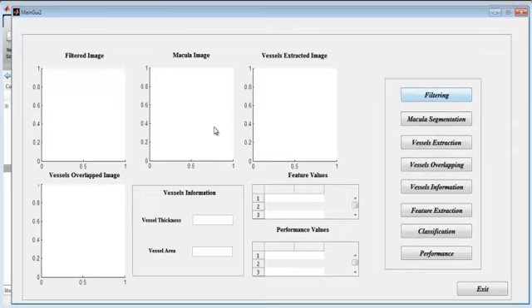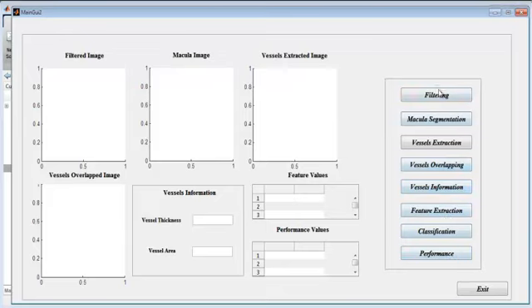In main GUI 2, we can see filtering, macular segmentation, vessel extraction, vessel overlapping, vessel information, feature extraction, classification, and performance. In filtering, we do bilateral filtering to remove the noises. When you select the filtering option, the filtered image appears.